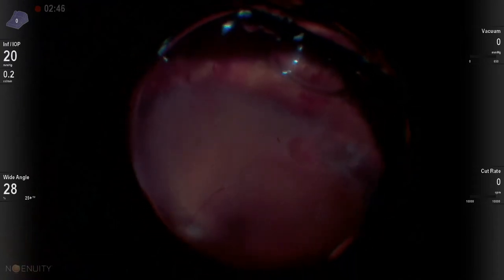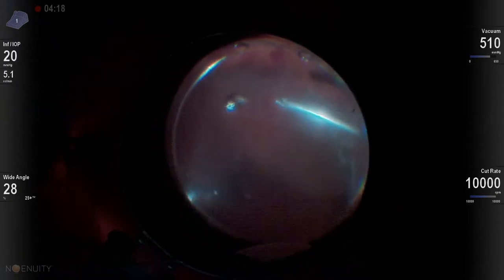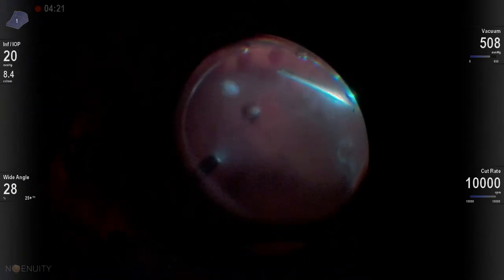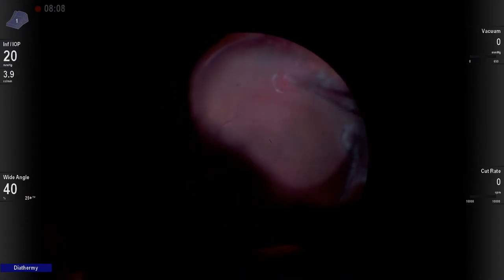This is a patient who had failed a primary vitrectomy and had a horseshoe tear that was the cause of the primary failure, inferotemporally, with some early PVR. If you fail a primary vitrectomy, you most certainly need a scleral buckle to help support the peripheral vitreous.